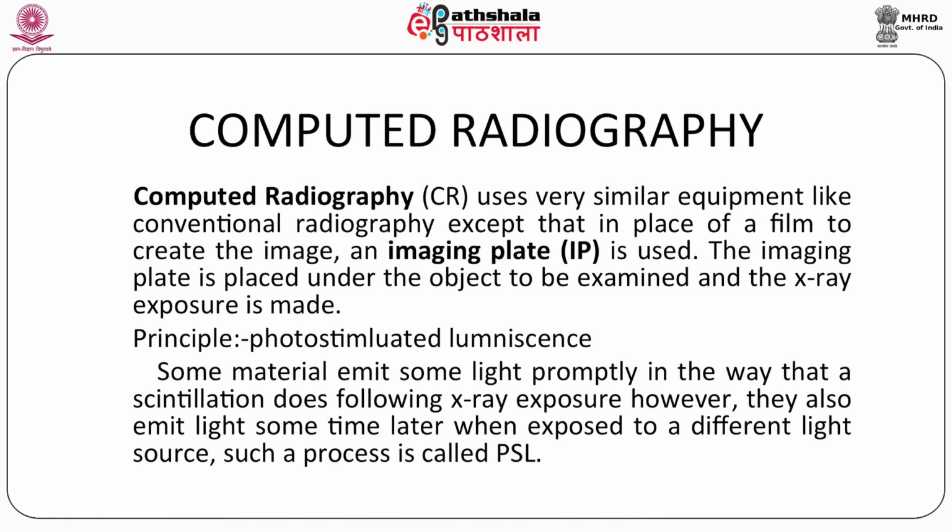CR image acquisition, as you can see in the figure, has been described. The patient is standing, the PSP records the latent image formation, and then this latent image is read out by using a digital image reader.